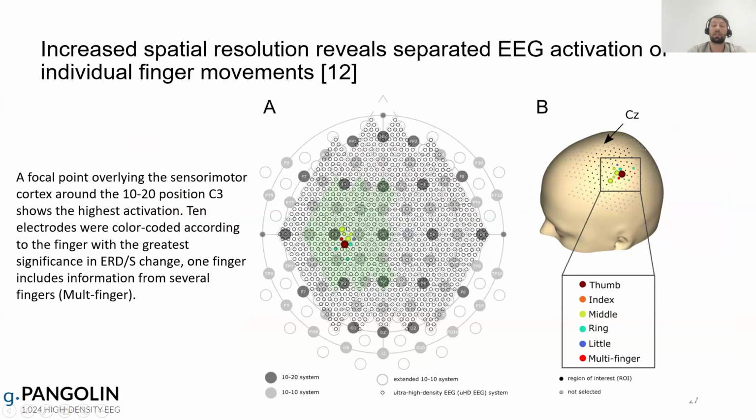So you can see just the surface of a couple of significant electrodes we have here would be, let's say, 2 standard EEG electrodes. So that's something that you couldn't differentiate as well as we can do it with the system.